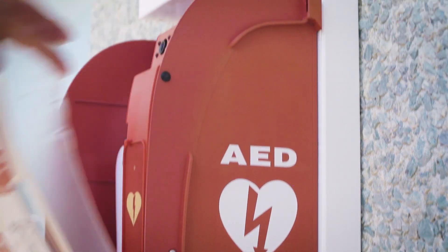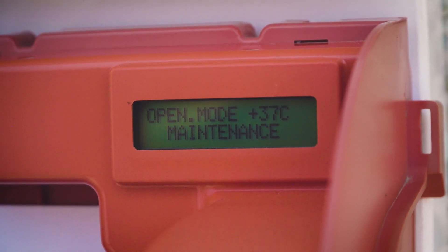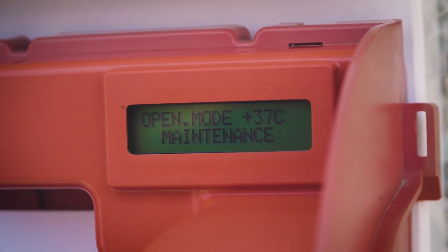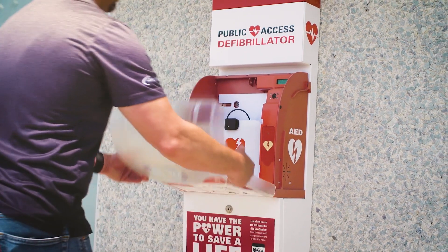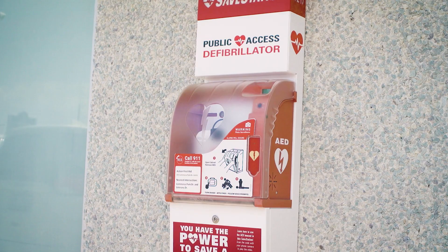It is now safe to open the cabinet's cover. When the maintenance is complete, simply close the cover and the cabinet's alarm will automatically rearm itself.